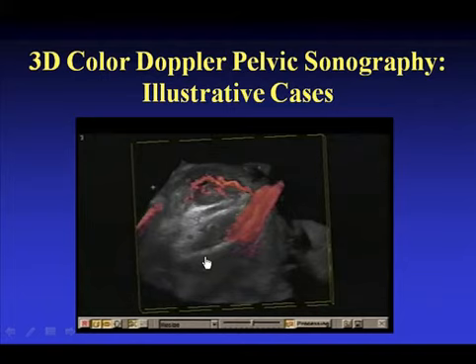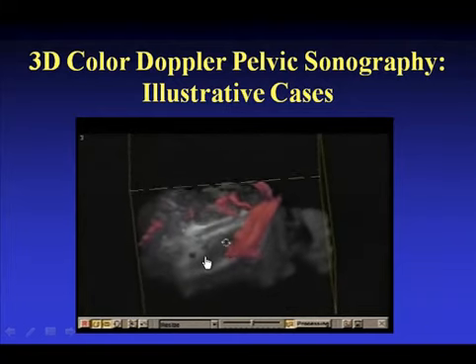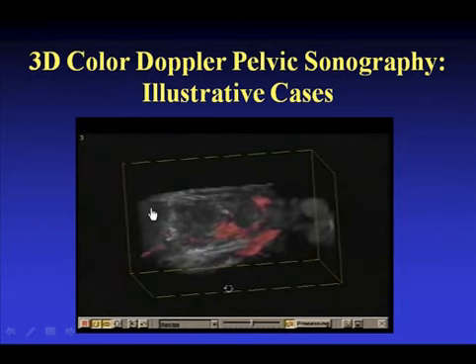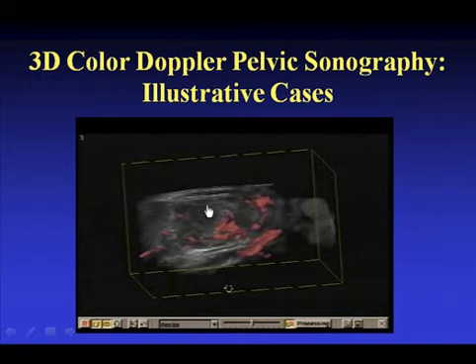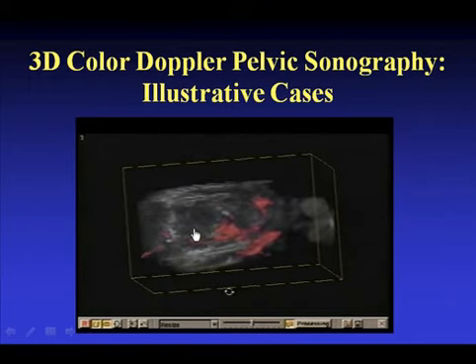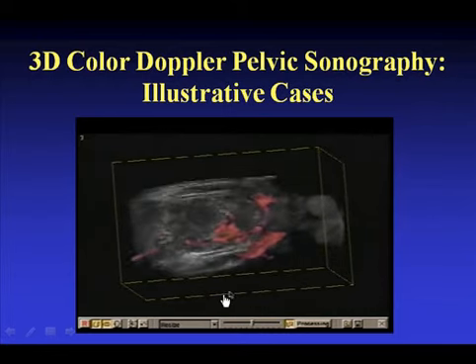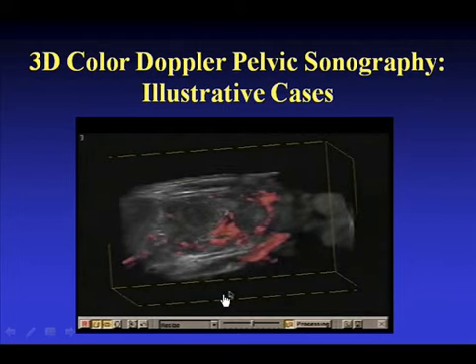And here we cut the top of the lesion, bloodlessly I must add, and then we take the volume and tip it, and we can look into the lesion, and we can see that yes, I could aspirate a few of these small locules, but the needle would be traversing all the vessels inside of this tubo-ovarian abscess, and that would not be a great idea to perform.